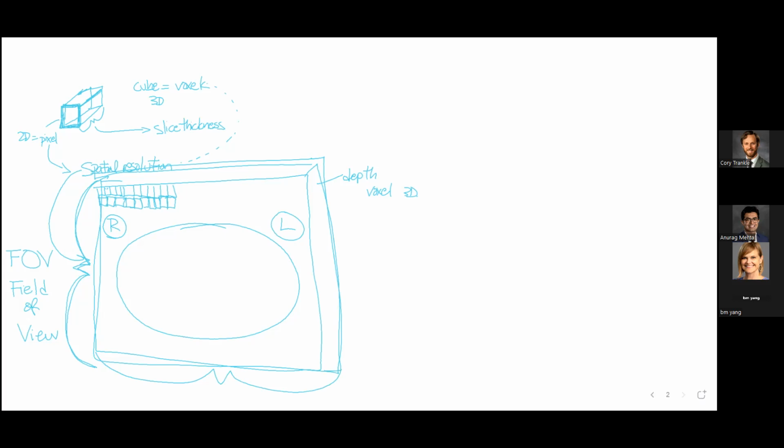So that's one thing we set. But there's another thing that we have to set. What is that? Resolution. Yeah, but what is that? Matrix. The matrix. What is the matrix? Well, the field of view is the length and the width. What's the matrix? Well, yeah, but what is the matrix?